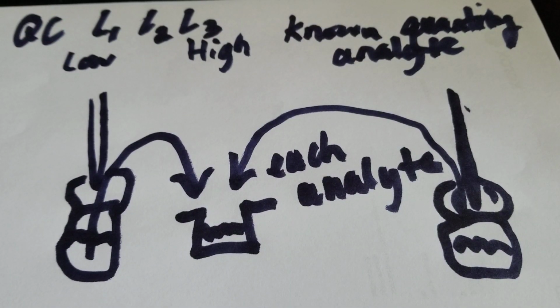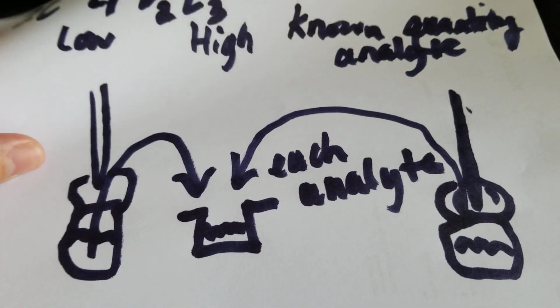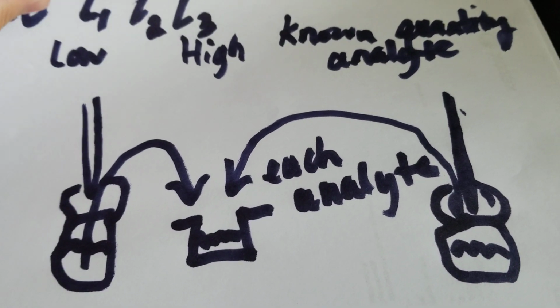All right. Okay, so now that we know what QC is and why we use it, let's talk about how we actually calculate it. All right, why would we need to know how to calculate it? Well, there is one main reason, and that is because if you have an analyzer whose computer goes down, you may need to calculate it in downtime. And in order to make sure that you're providing specimen results that are accurate, you would need to make sure to know how to do that.